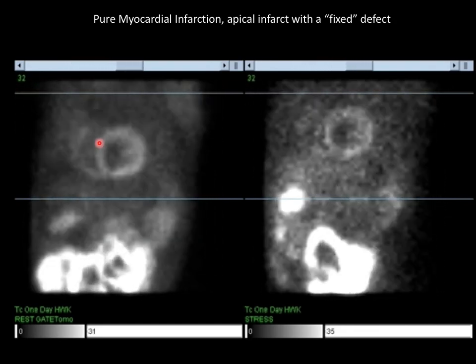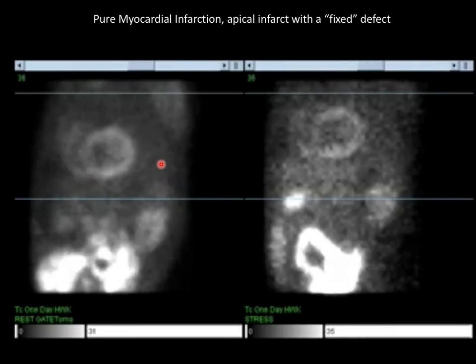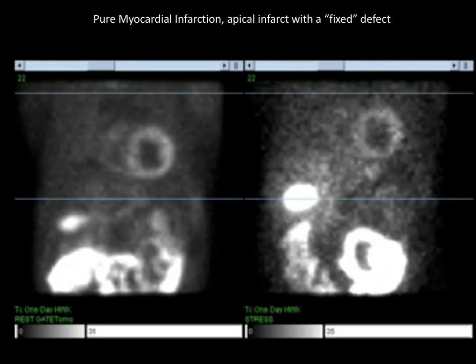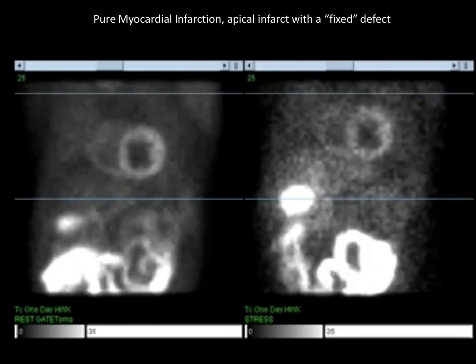There's the right ventricle here and the left ventricle there. When it comes around, excuse me, let me get my arrow back. When it comes around to that orientation, that's the short axis view. Basically, we're looking straight down the barrel of the heart. And then we rotate here, we can see kind of a long axis view, right?